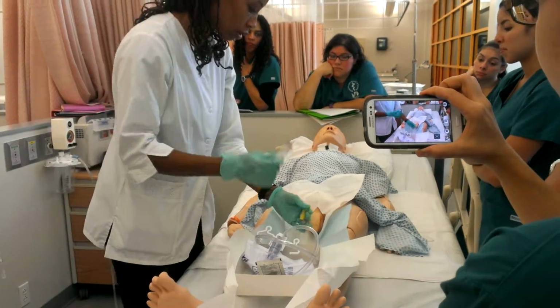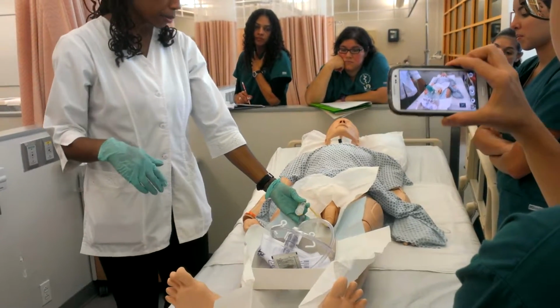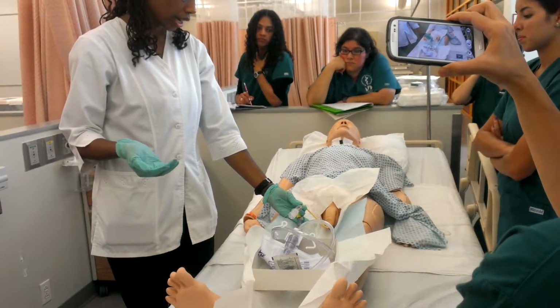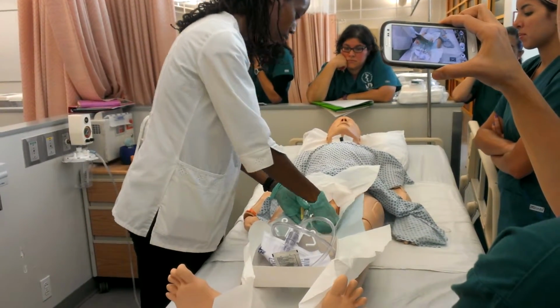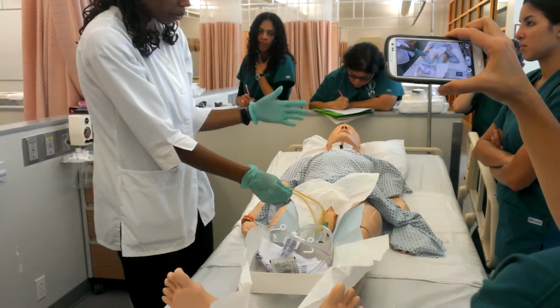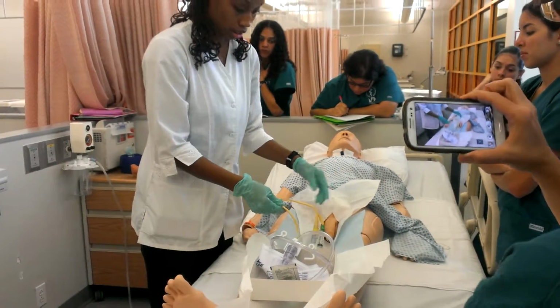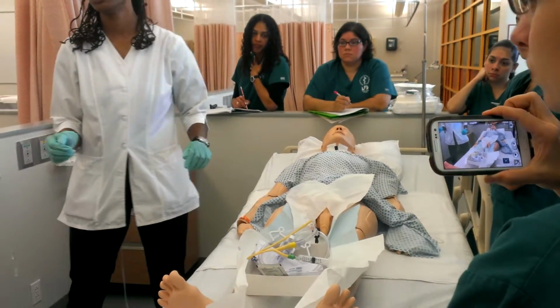And then the same thing to remove, you just attach your syringe and you just wait till it stops. And you tell them to take a deep breath in and to exhale, and when they breathe out, you pull out as quick as you can. And then they're just going to feel burning. Oh, that burns, but it's out. And that's it.